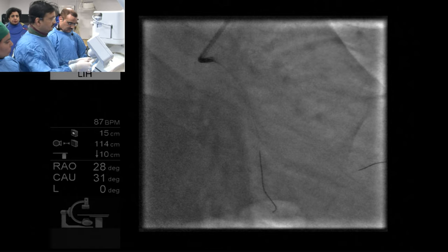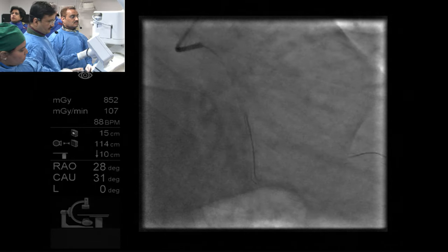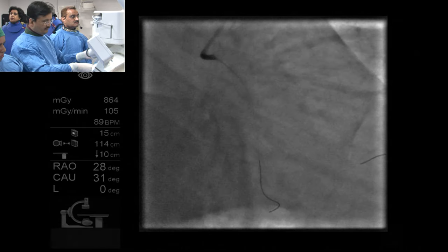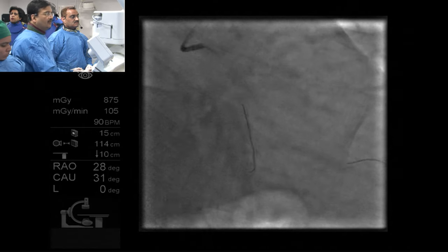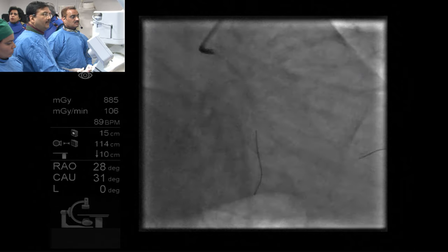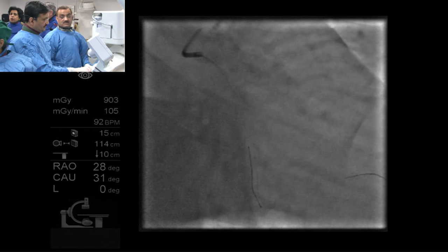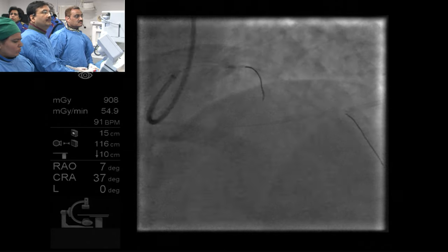That was our initial work, but nowadays we do modified jailed balloon, meaning that half of the balloon is inside the side branch and half inside the main branch, overlapping the stent, and both the balloon as well as the stent balloon will be inflated simultaneously at 6 to 8 atmosphere, and then deflate the stent balloon as well as side branch balloon, then pull back the side branch balloon, and we see the cine, whatever the position of the side branch. Cranial, if the side branch is all right, we do not do anything for further side branch. If side branch is grossly pinched or TIMI flow is impaired, then recross and final kissing balloon inflation done.